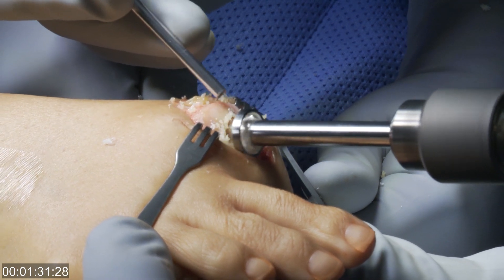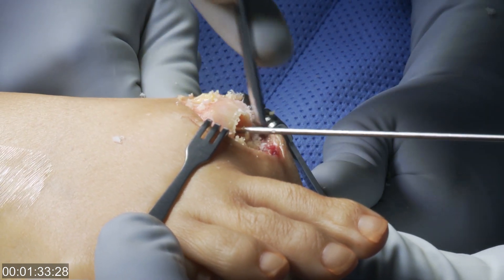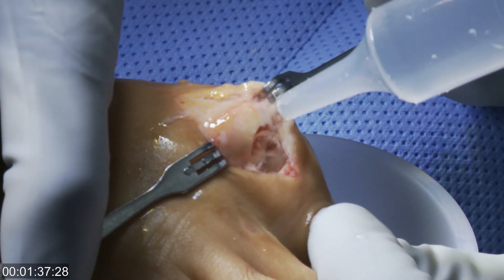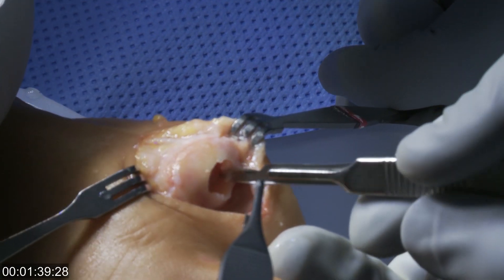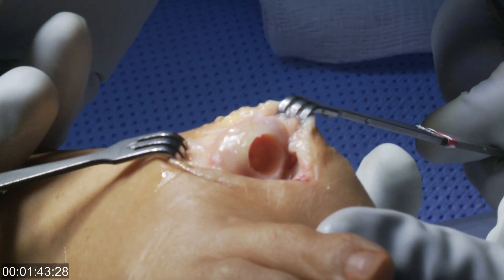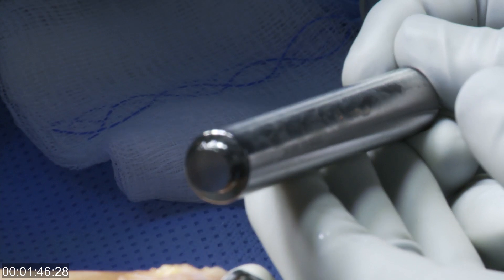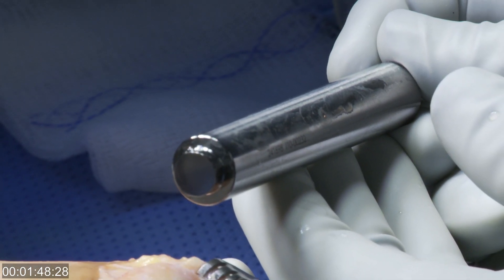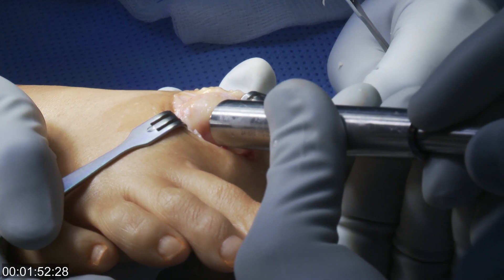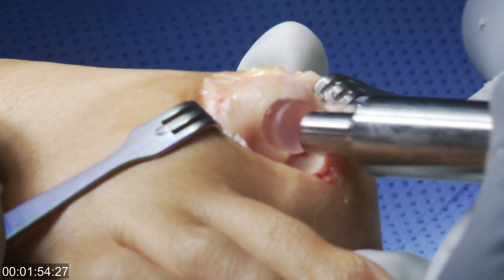We drill into the center of the metatarsal head and clean it up. Now we have a hole that will accept the articular cartilage implant, which is a hydrogel product that has some compressibility. It's very durable, and it has properties very similar to articular cartilage.